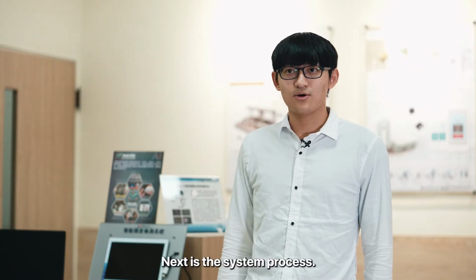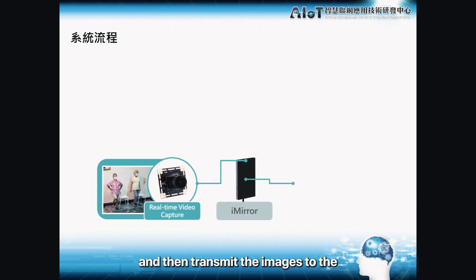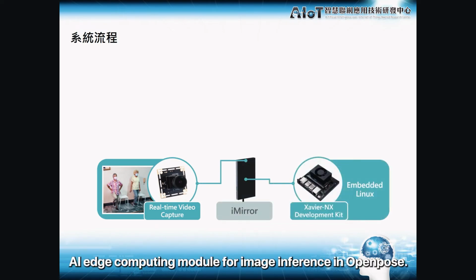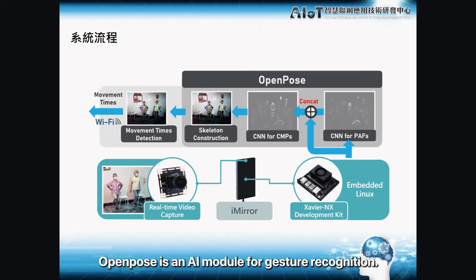Next is the system process. Our system will obtain continuous images through the camera lens, and then transmit the images to the AI Edge computing module for image inference in OpenPose. OpenPose is an AI module for gesture recognition.